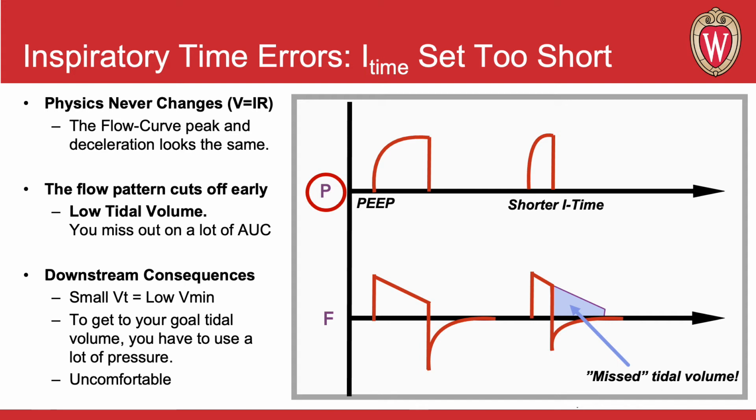And that might not be very good for you. Now, alternatively, if you don't correct the flow or the tidal volume with more pressure, you get a very small tidal volume and a low minute ventilation can result. And that is also not optimal.